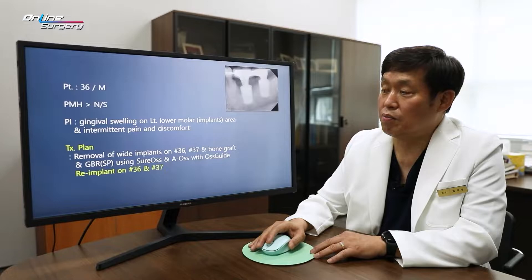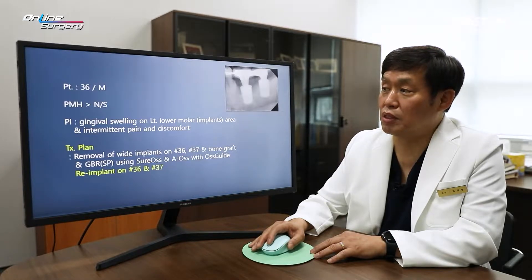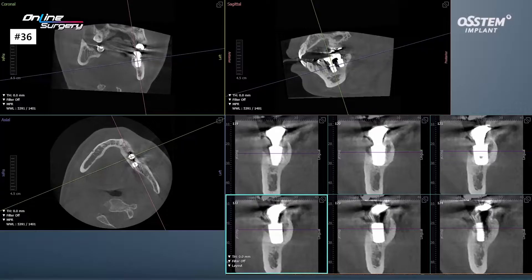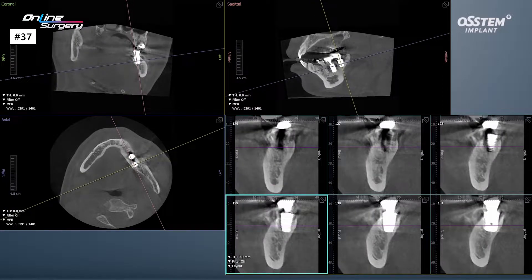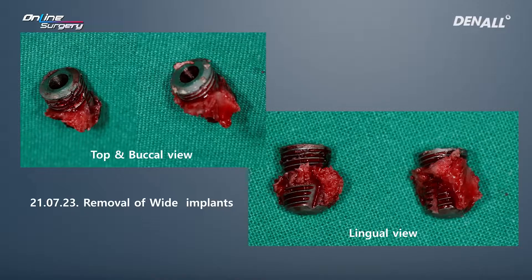I plan to place two implants in the area where the implants were removed. Before implant removal, you can see alveolar bone loss around the wide implants. When the prosthesis is removed, gingival swelling and peri-implantitis can be observed, along with a tendency for alveolar bone destruction. Implants were removed and bone graft was done.